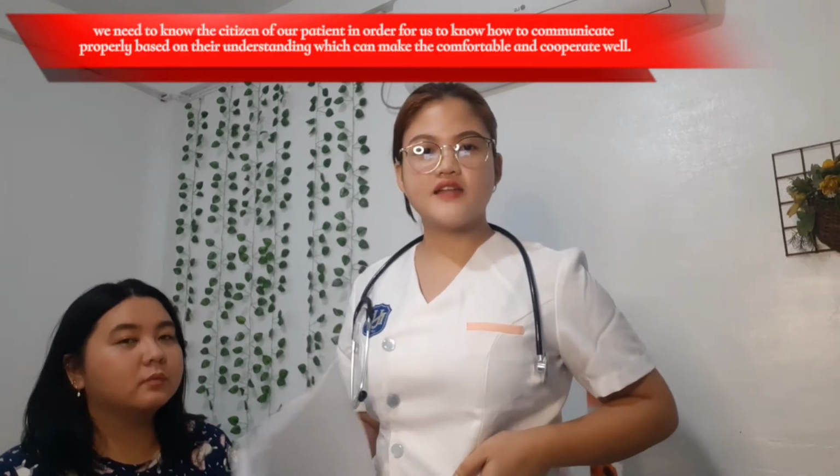That's why we need to know the citizenship and the language of our patient in order for them to cooperate properly and be comfortable as well. For the assessment, you need to determine the client history including the acute and chronic health problems. The rationale is that clients with carbon dioxide retaining chronic obstructive pulmonary disease, which is COPD, will need lower amounts of oxygen so as not to obliterate their hypoxic respiratory drive. They may already have oxygen which they need as long-term therapy. So, I will ask you, ma'am, nagkaroon na po ba kayo ng asthma before?